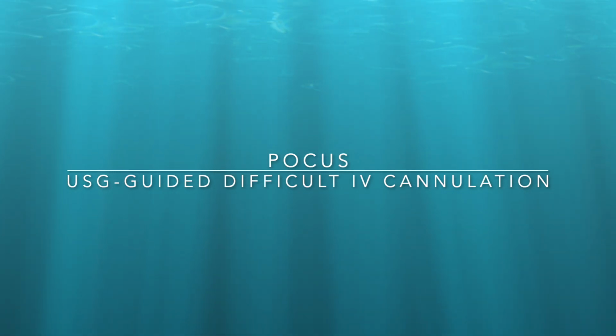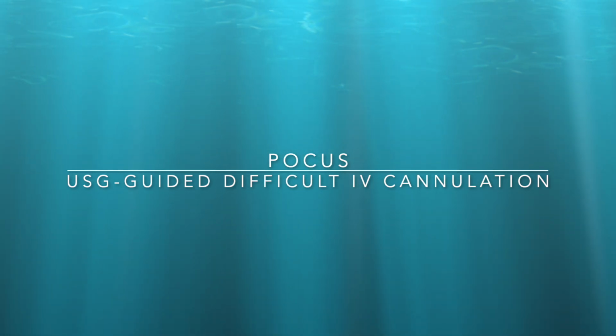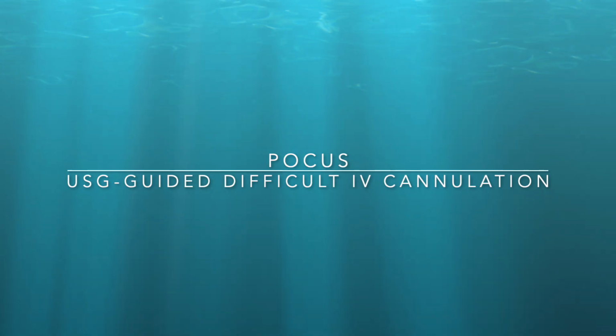In this video, I am going to demonstrate how you can perform USG guided IV cannulation.